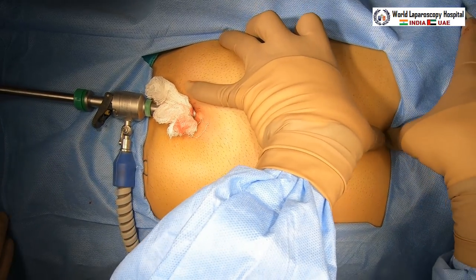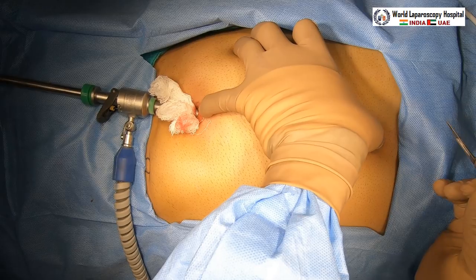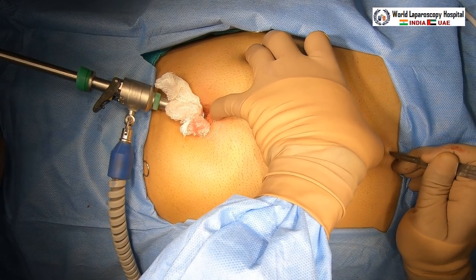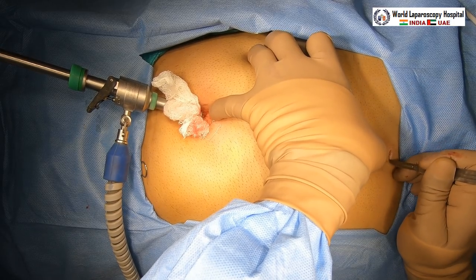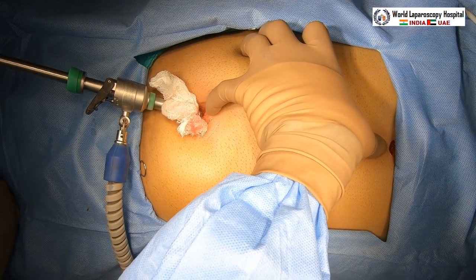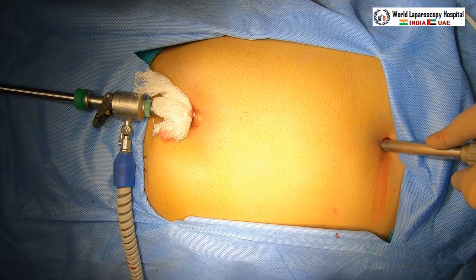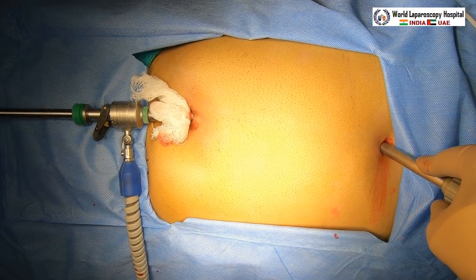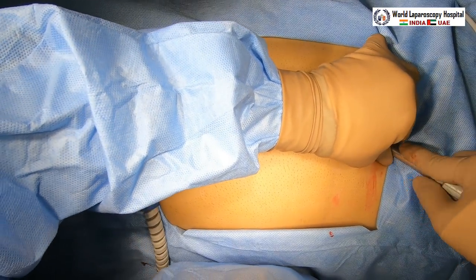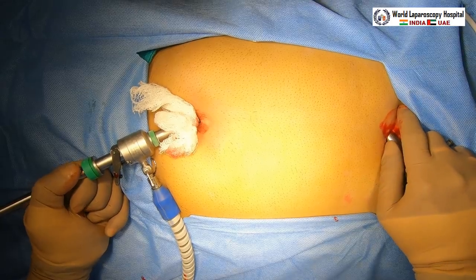Another port is placed just below the xiphisternum and left of the midline. This is also 11 mm, required for the clip applicator. Initially go perpendicular and then pierce the falciform ligament to enter to the right of the falciform.